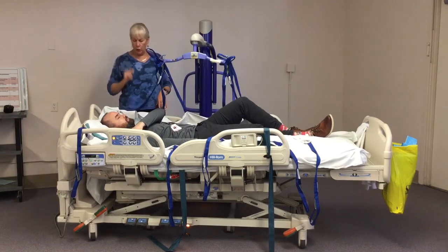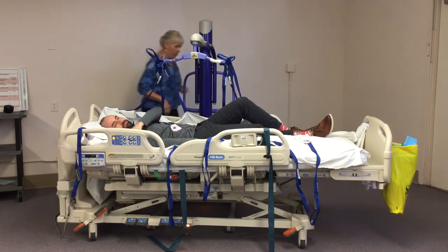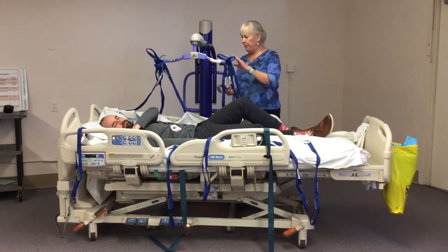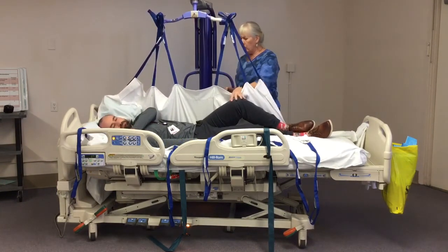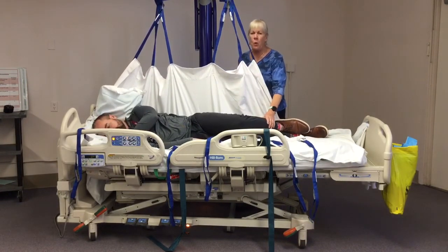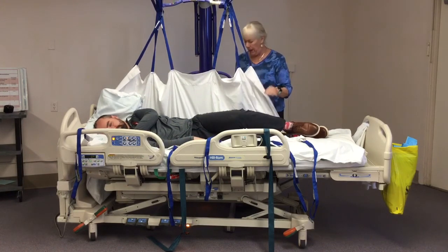And when you get your patient to look in that direction, his whole body wants to roll, okay? Now what I'm going to do is lift my patient up. On 3, 1, 2, 3. And what I'm going to try to do here is roll my patient enough that he's about 51% of his weight in that direction, because I've lifted him up just enough that when I lower him back down again, he doesn't roll back.